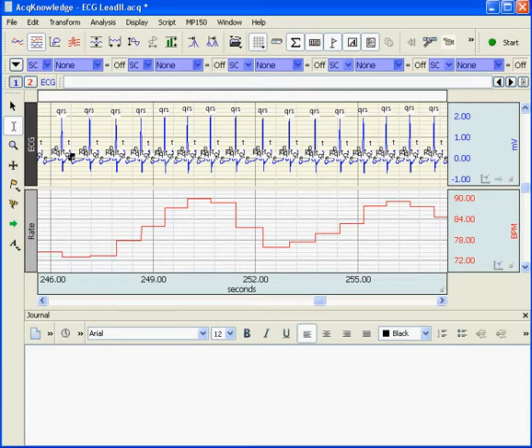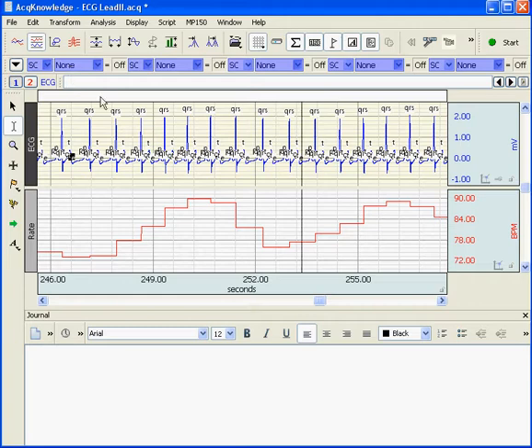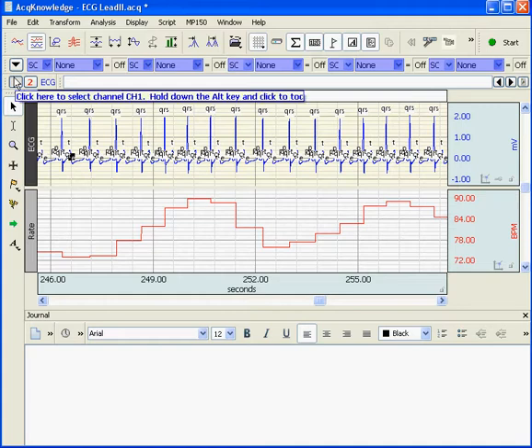When you first open Acknowledge with a file of sample data or previously recorded data, more often than not the measurements are set to None and the channel is set to SC. The first thing you need to pay attention to is the channel you want to take the measurement from and the type of measurement you want to choose.